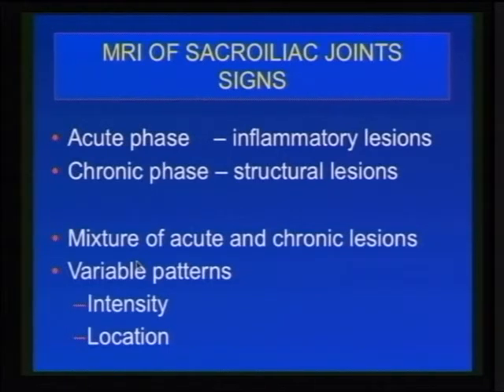The chronic stage is stage 3 of Modic, which is low and low, which is sclerosis, low signal intensity on T1, T2, and the STIR images. So that is the burnt out case. What we really need to do now is concentrate on the T1 weighted image for the structural damage.